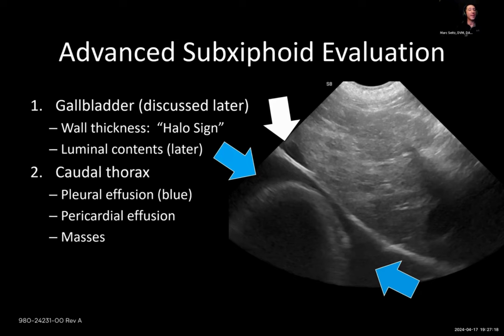And then finally, I've been unlucky enough to find some pulmonary, mediastinal, and esophageal masses from this location. But wow, was that valuable information, because those animals were presenting with vomiting, diarrhea, GI signs, et cetera, et cetera.